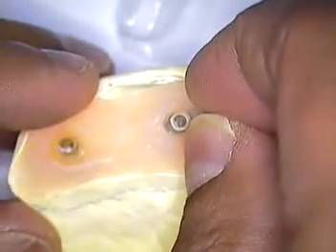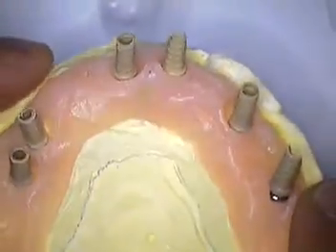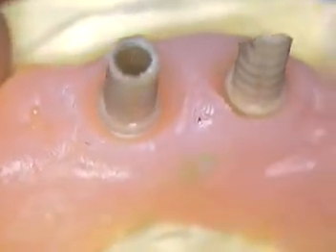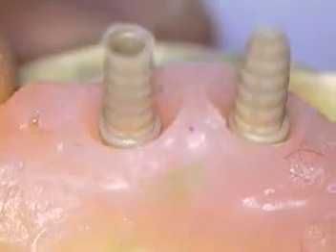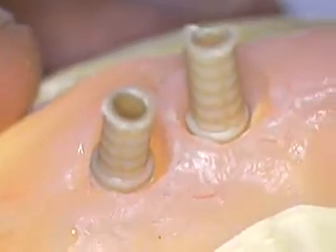Each one of these is removable, and they're also made of plastic. So why are we showing you this? Well, number one, I wanted to show you that each one of these abutments has an area of emergence profile or soft tissue around each. These two are number 8 and 9, and you can see the areas of impression transferred now to the soft tissue model itself. This is the upper right. Those are the two bicuspids, number 4 and 5, and then all the way back to number 2.